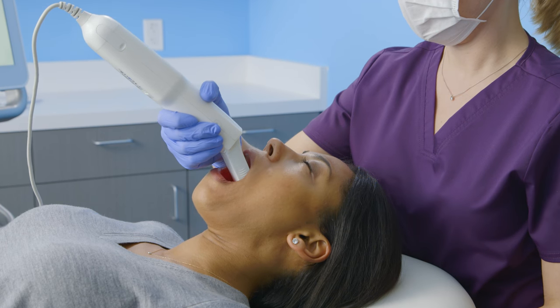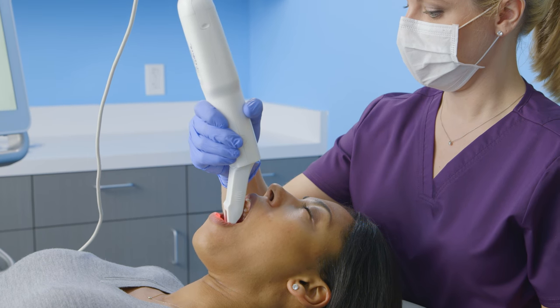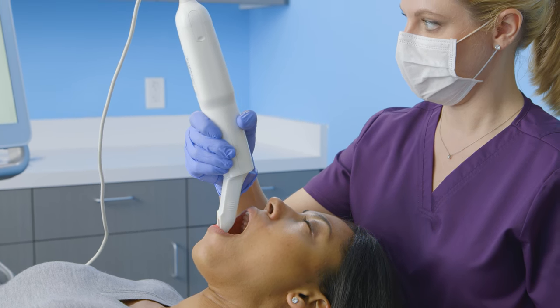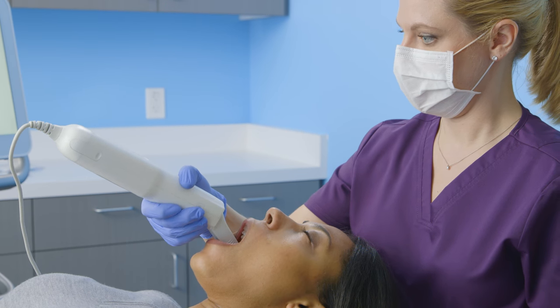In the occlusal scan, when I come to the anterior 6 teeth, I tip the cord end of the wand up to capture more surface area and lingual anatomy, rather than scanning only the incisal edges.